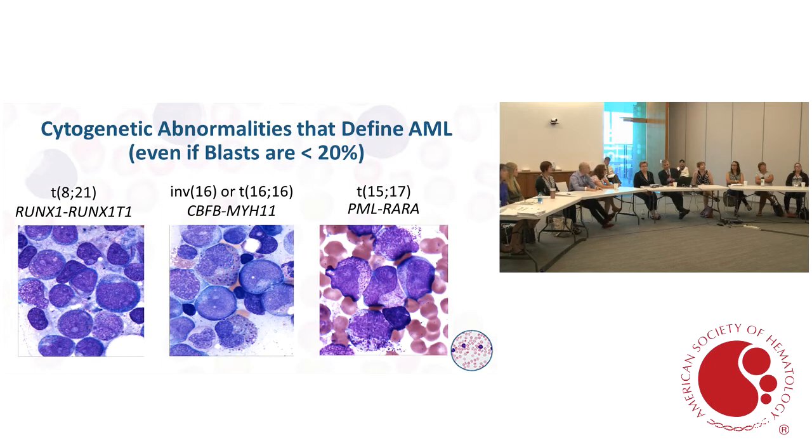And these have typical morphologic features, so often the pathologist will suspect these on the smears before the cytogenetics comes back. And we can FISH smears, so you don't have to wait to get an aspirate sample to the lab and to culture. We can FISH the smear or a touch prep. We talked a little bit about APL, but just be aware that other AMLs can have, of course, DIC, and conversely, APL can present without any overt DIC, but can be precipitated if cytolytic therapy is given without ATRA. And there are different ways to confirm it.